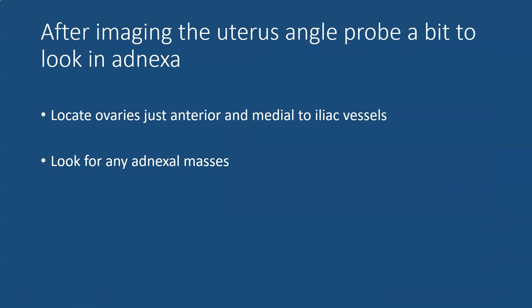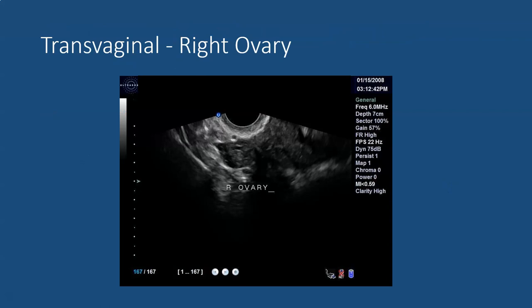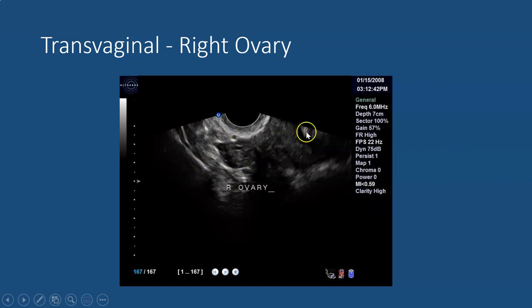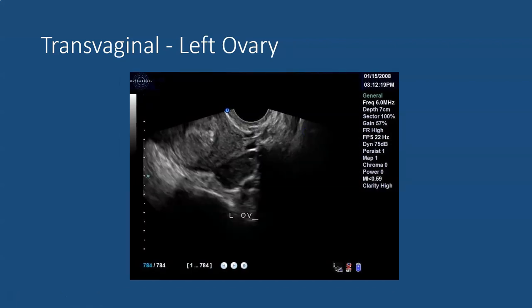After looking at the uterus we're going to angle a bit to the right and to the left obliquely, trying to identify the ovaries as well as any other adnexal masses. The ovaries can usually be identified as being just anterior and medial to the iliac vessels. This transvaginal image shows the iliac vessel with the right ovary just anterior and medial; the uterus is seen to the right of the screen. Looking in the left adnexa one can see the left ovary, and towards the left side of the screen you can see the uterus.